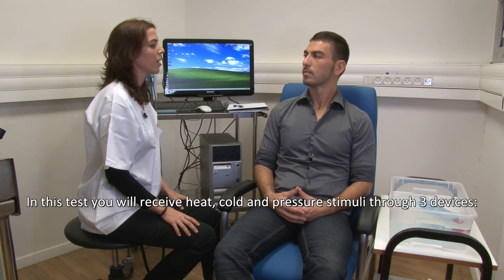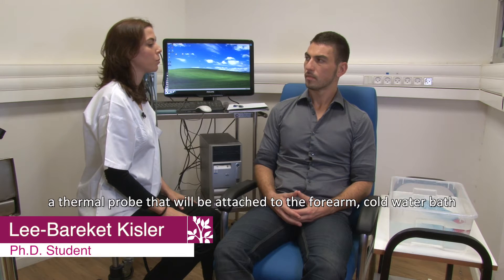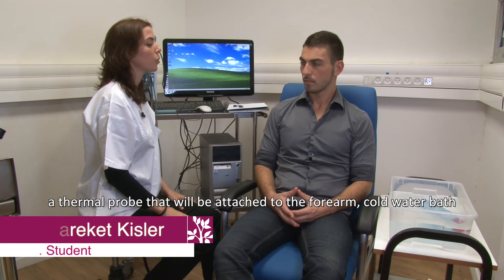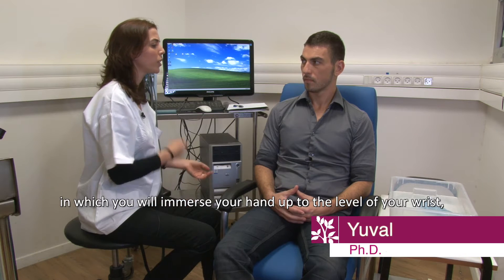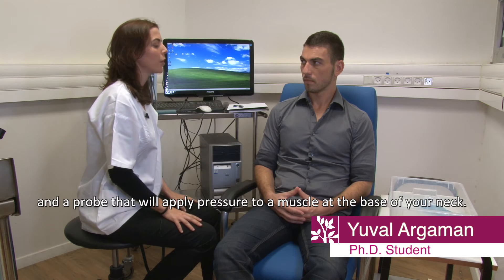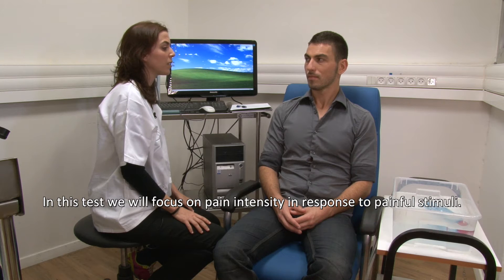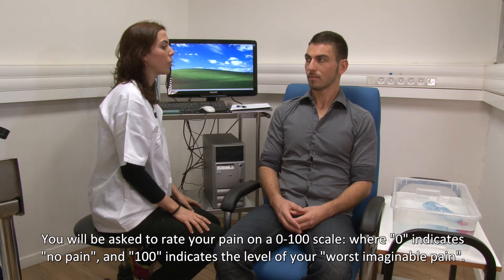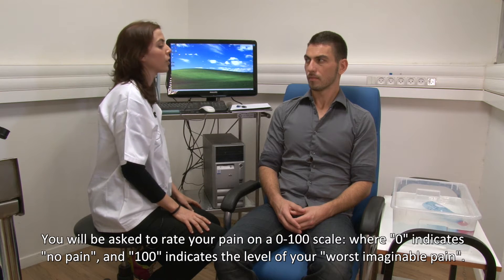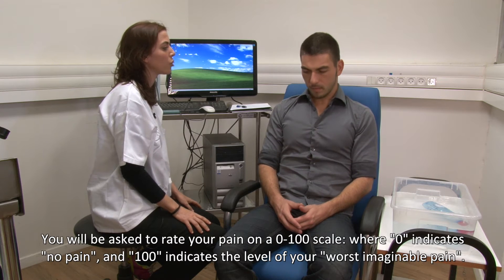In this test, you will receive heat, cold, and pressure stimuli through three devices: a thermal probe that will be attached to your forearm, a cold water bath in which you will immerse your hand up to the level of your wrist, and a probe that will apply pressure to a muscle at the base of your neck. We will focus on pain intensity in response to painful stimuli. You will be asked to rate your pain on a 0 to 100 scale, where 0 indicates no pain and 100 indicates the level of your worst imaginable pain.